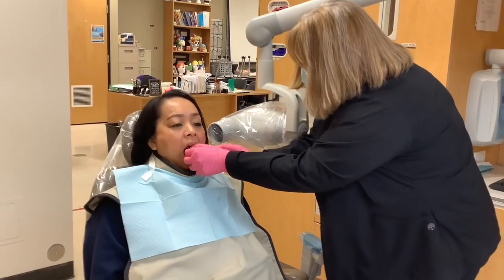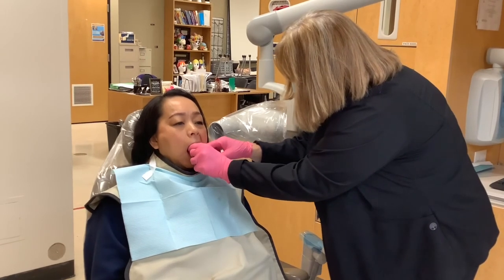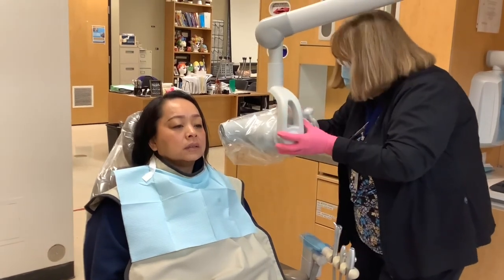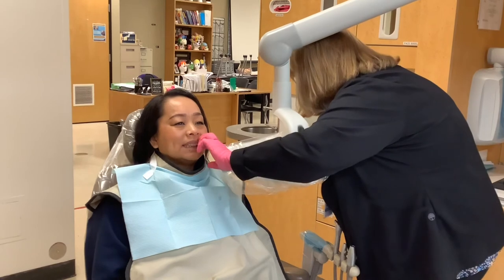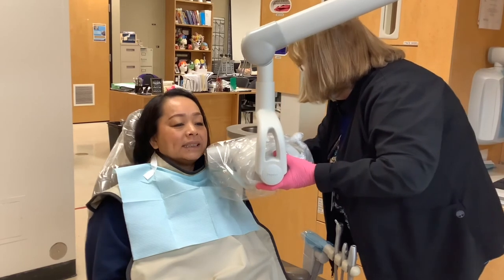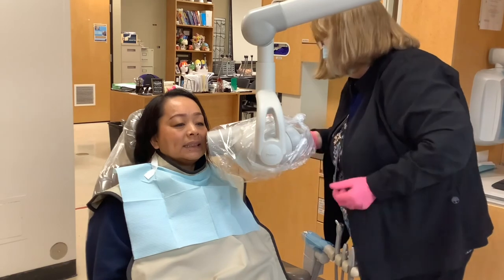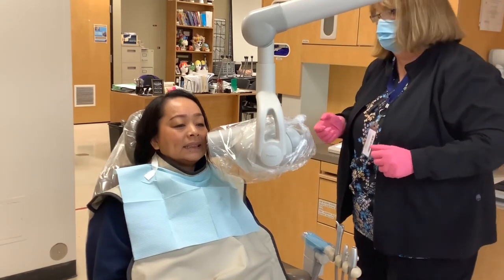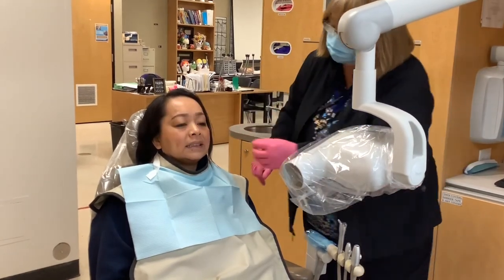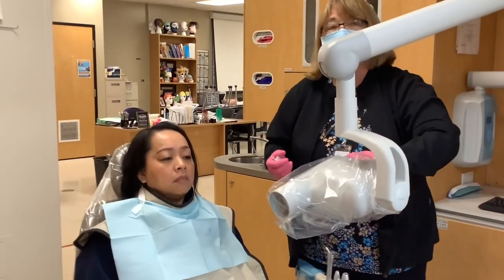Get a new x-ray — now I'm doing the bicuspid bite wing, right down. Still at the same angulation, between zero and five. I see my angle of my film is like this, so my cone head has to be like that. Line it up — there's my shot. And you do it the same for the bicuspids and the molars on the other side, and you should have your perfect FMX.